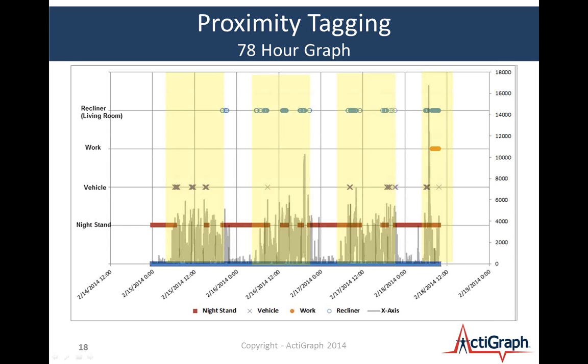Had another question from Wilshaw about any guidelines to reduce interference. We don't currently have any guidelines because of the uniqueness of each environment. The guideline that we have on our website is that we encourage users to mount the devices at subject chest height with the front of the device facing outward. We found in our testing that does help, but with regards to anything else to reduce interference, we do not currently have any information on that. We are using the standard Bluetooth stack, so if you visit bluetooth.org, you'll find that they may have some indication of ways you can reduce interference in your environment.